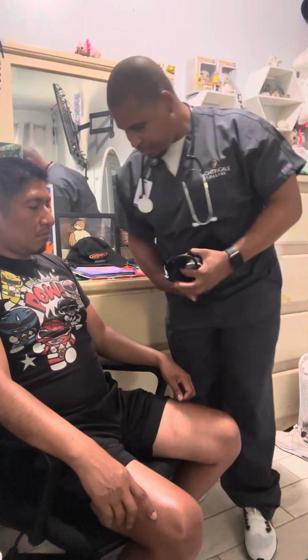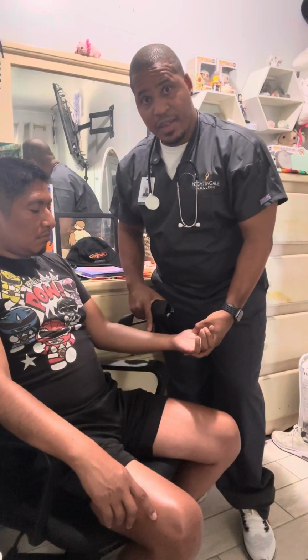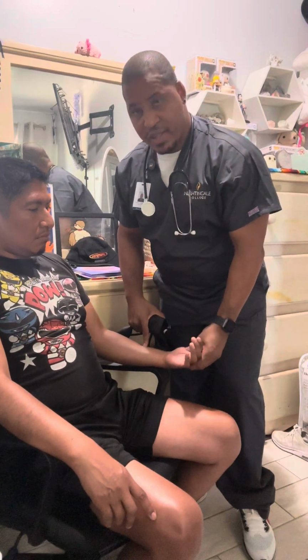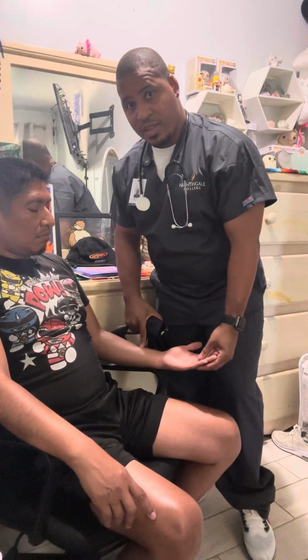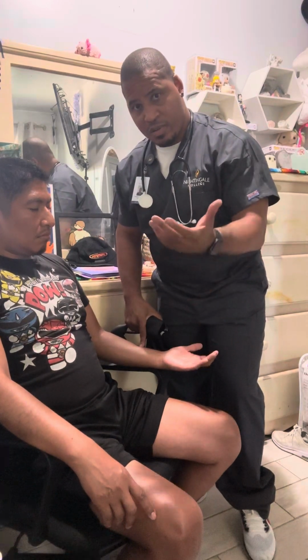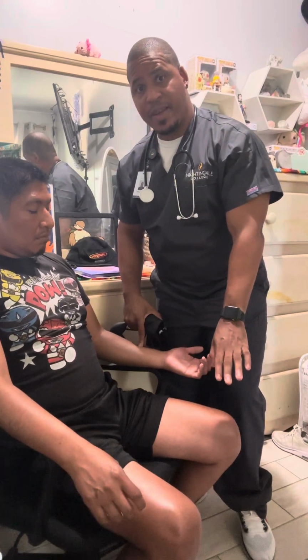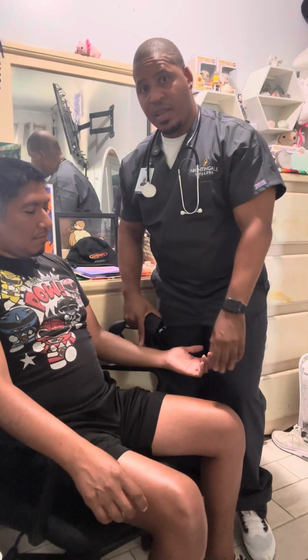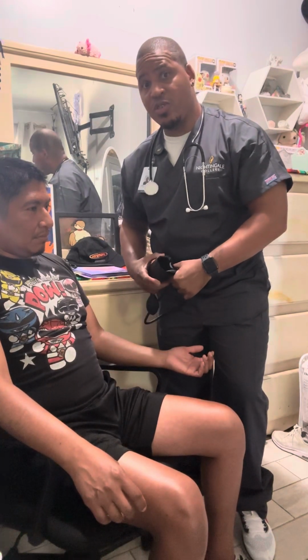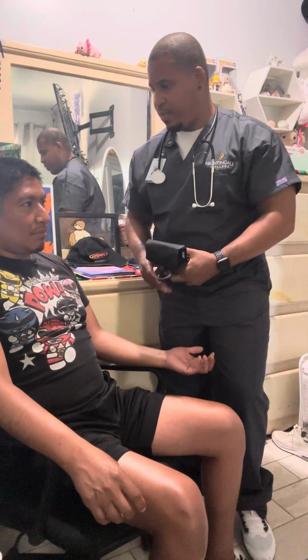First, I want to make sure his arm and palm are facing up, at heart level. I also want to make sure his legs are planted flat and not crossed. Thank you. And I want to ask the patient, do you know your baseline for your blood pressure?